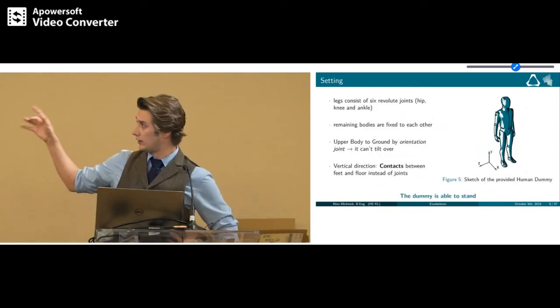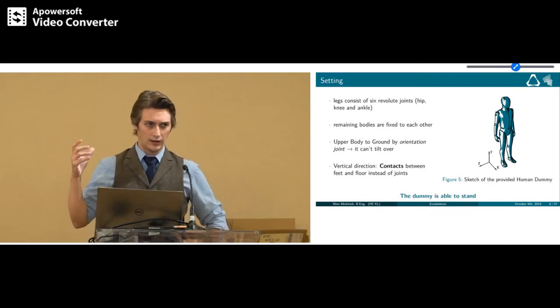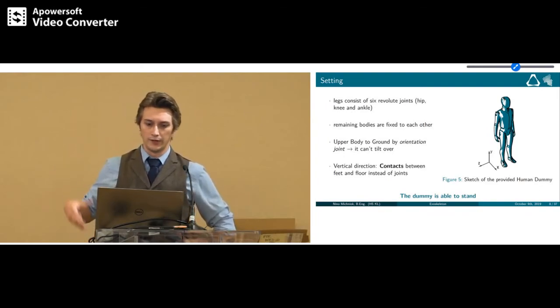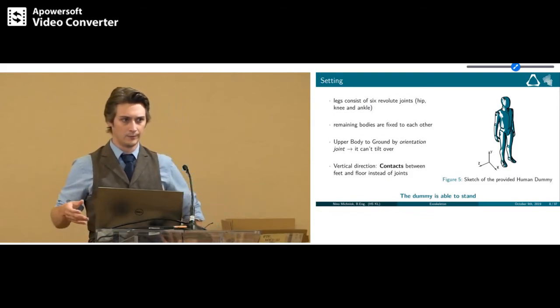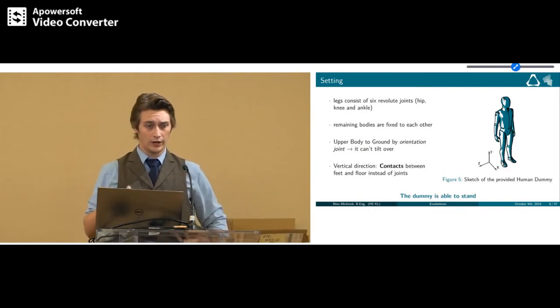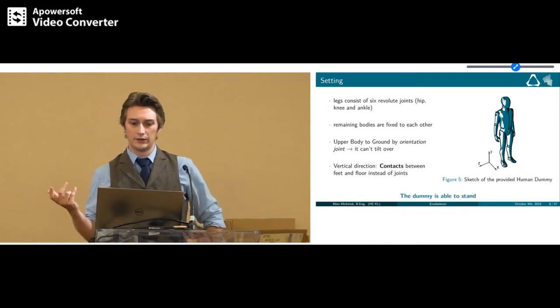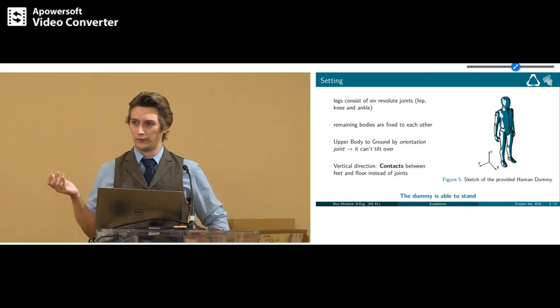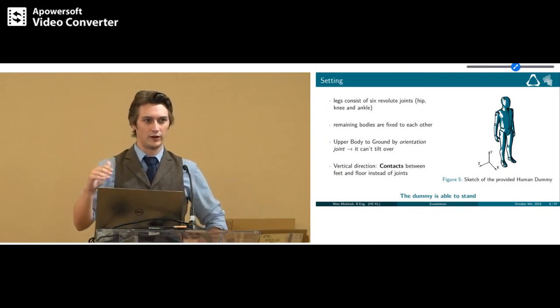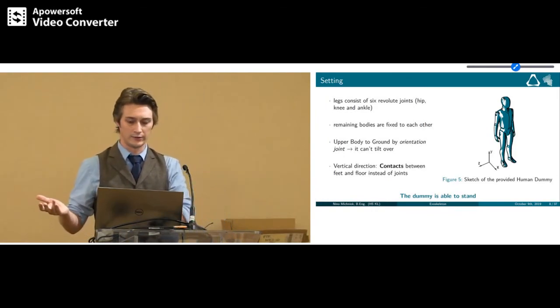You can see the coordinate system at the right. The degree of freedom of these revolute joints is about the z-axis. And each leg consists of 3 joints, one for the hip, one for the knee, and one for the ankle. And all the remaining bodies of this human dummy are fixed to each other. Now I had to link the upper body somehow to its environment, and I've used the orientation joint, which leaves the translational degrees of freedom, so it could move forward, backward, sideward, up and downward, but it constrains all the rotation. So this would be important later, so it can't fall over during walking or something like that.